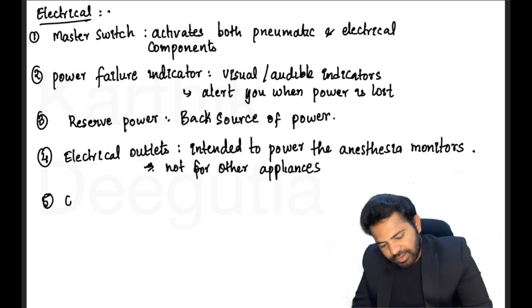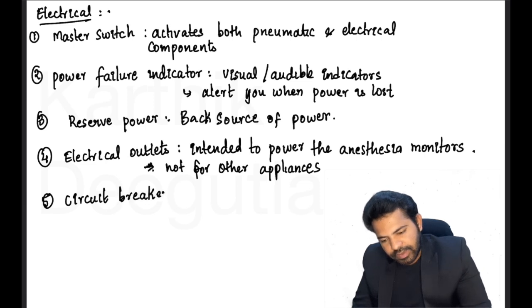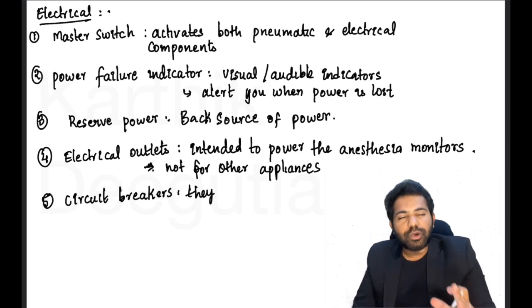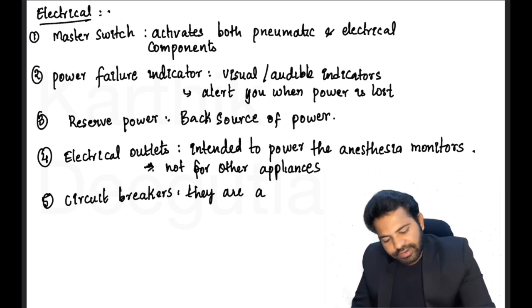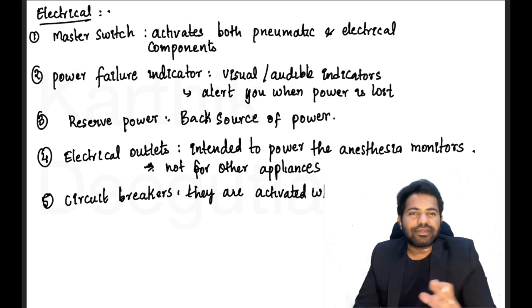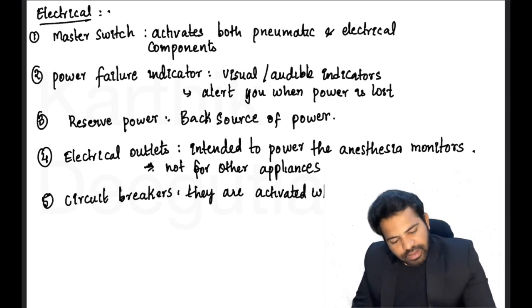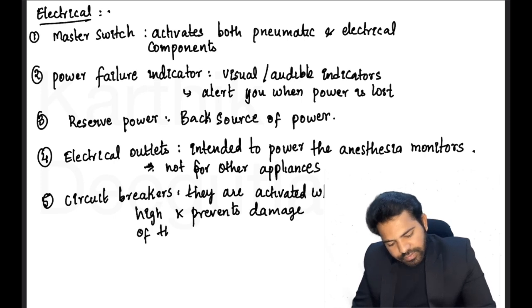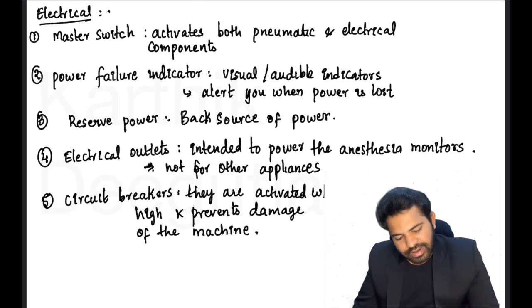Alright, then we have something called circuit breakers. These circuit breakers are activated when the load is very high, and this will eventually prevent the damage of the machine. Alright, I hope this is clear.